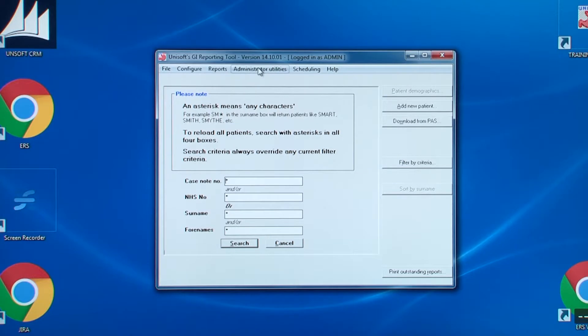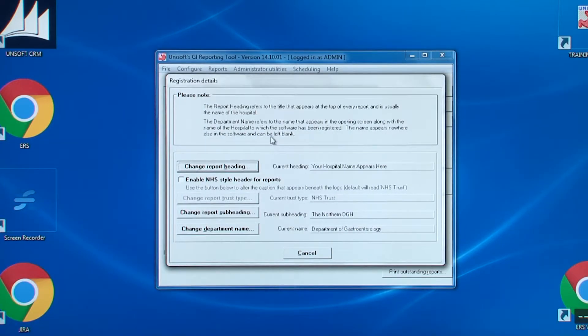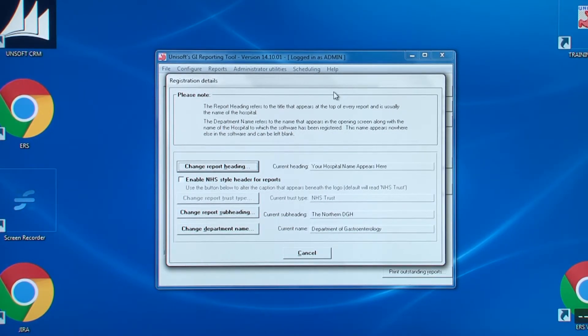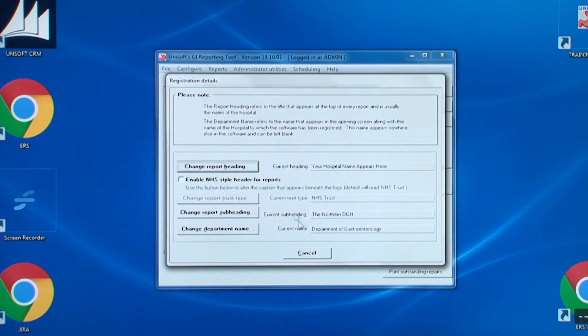The next entry is for the registration details. This allows you to change the heading on the report, the trust type, the report subheading and the department name. And that latter item only appears in the splash screen at login.